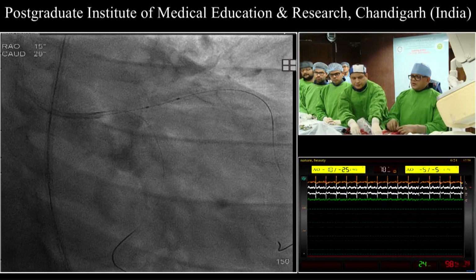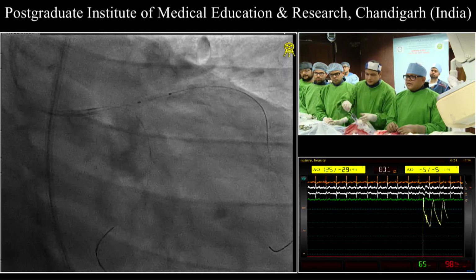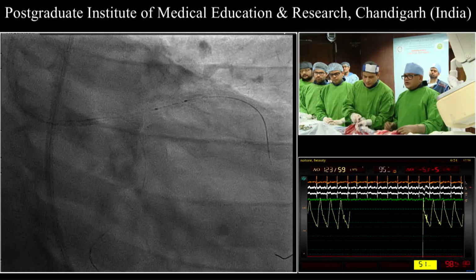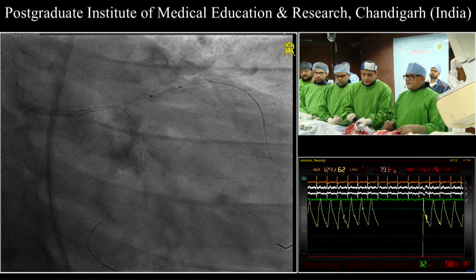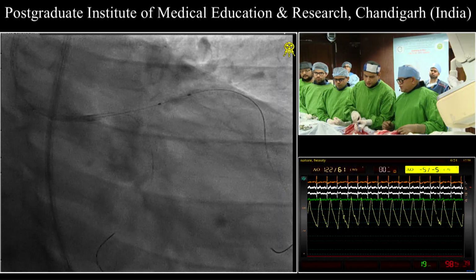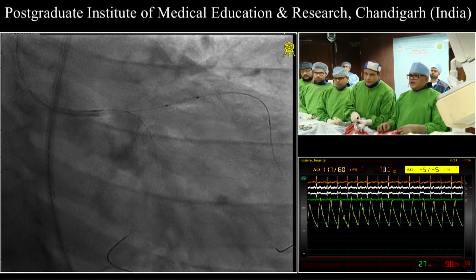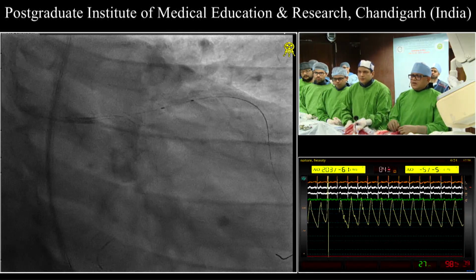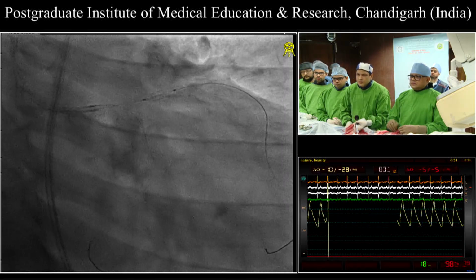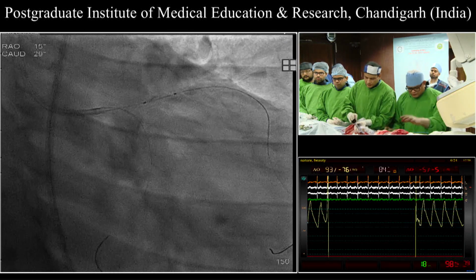So this is a 2.5, go up gradually up to 11.